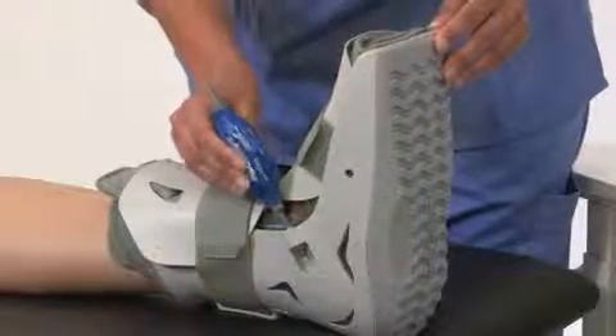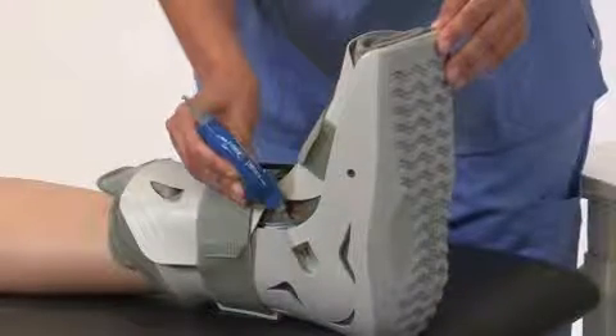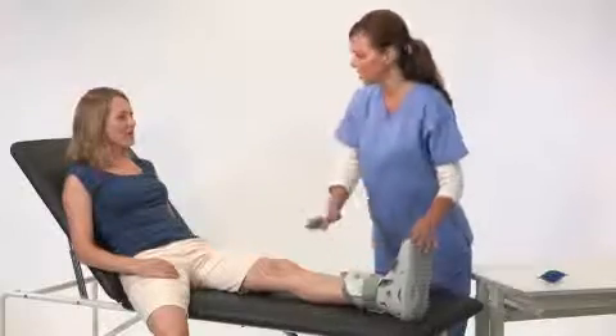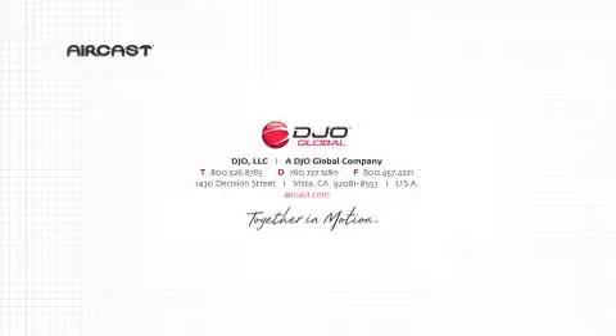If you over inflate the air cells, simply deflate them by inserting the deflate tip of the hand bulb into the valve and squeezing until you've found a comfortable pressure. Higher pressure provides more support for walking. Lower pressure is more comfortable when sitting or reclining.